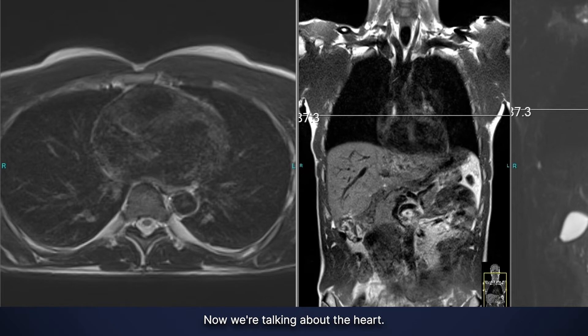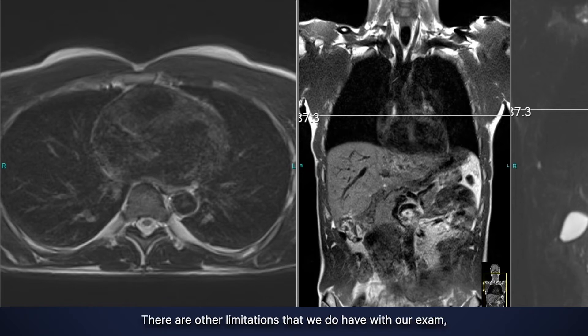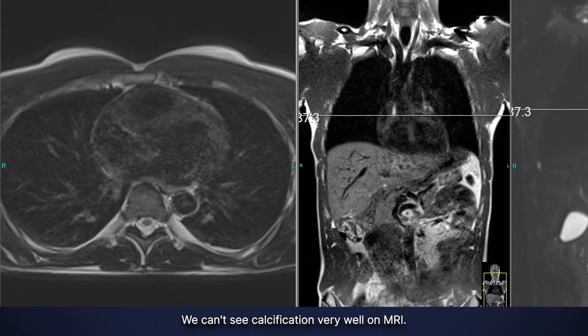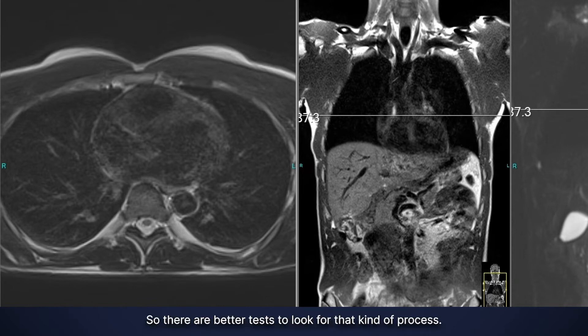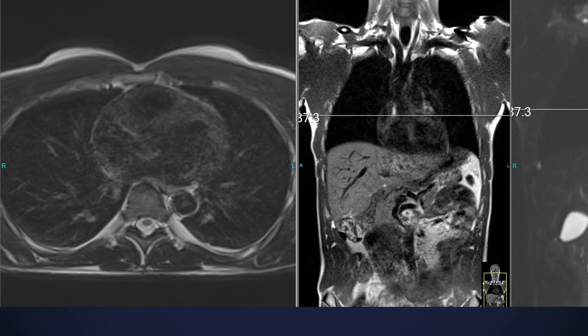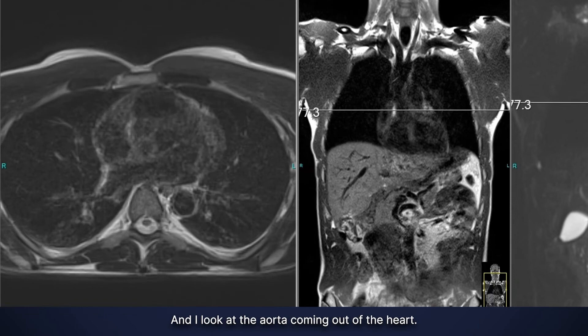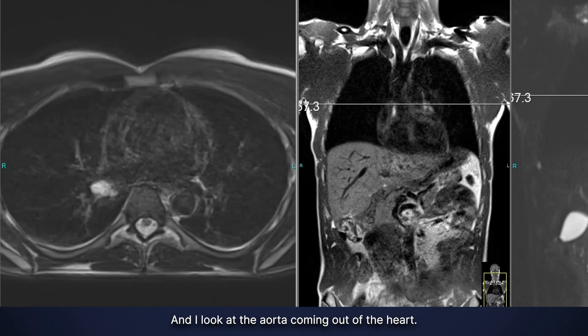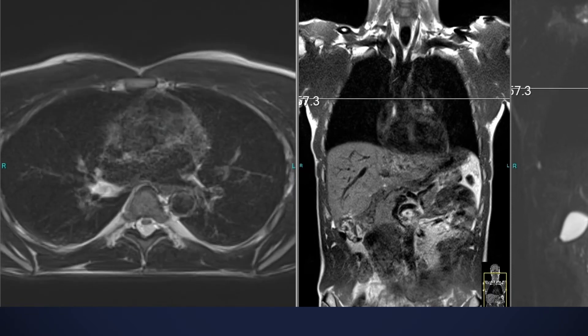Now, talking about the heart, there are other limitations with our exam — specifically looking for coronary artery calcification. We can't see calcification very well on MRI, so there are better tests to look for that kind of process. But overall, this heart looks very normal.